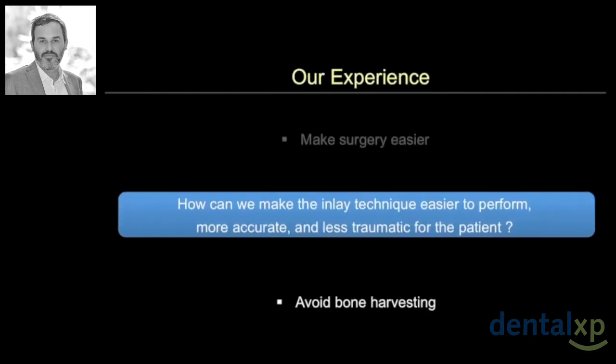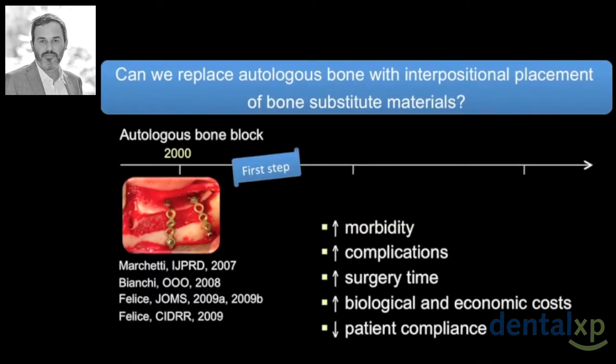The second aim was to see if autologous bone could be replaced by heterologous bone in the inlay technique. This meant less discomfort for the patient, lower costs, and an easy technique to perform under local anesthesia.